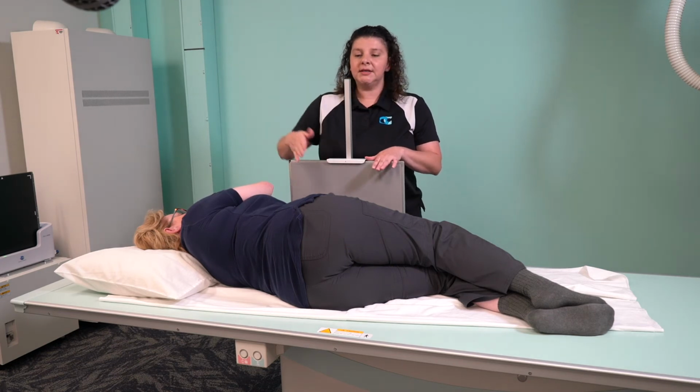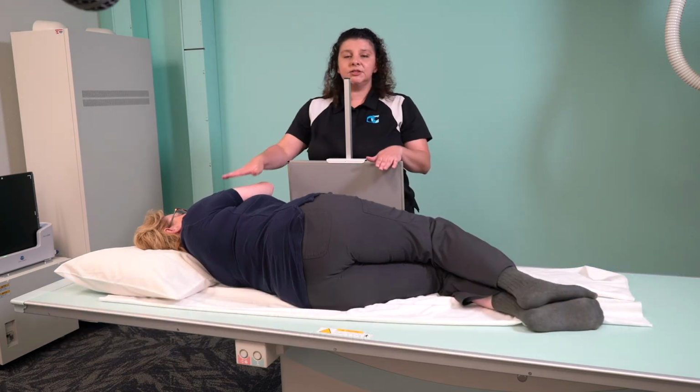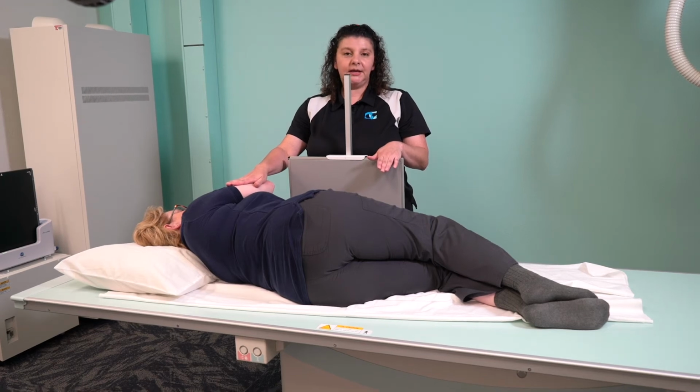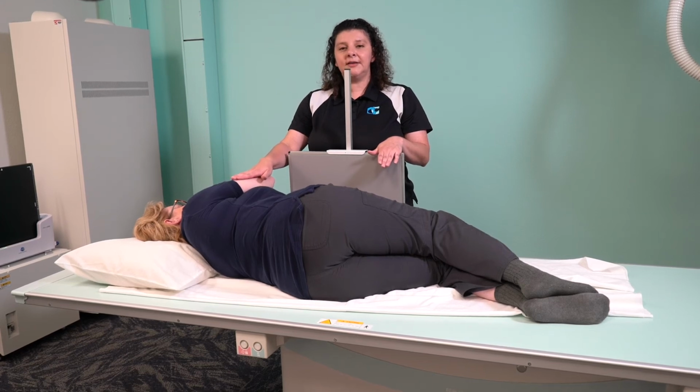Just imagine that our central ray is coming this way, horizontal. The way I have her here, this is going to be a left lateral decubitus because our central ray is horizontal and our patient is laying on her left side.